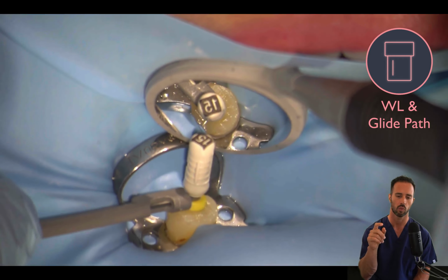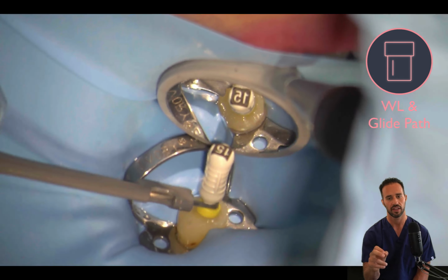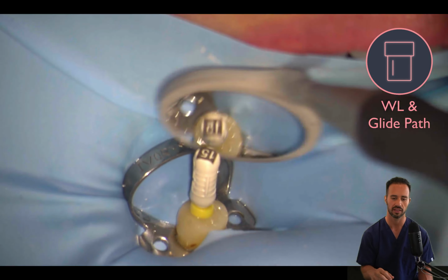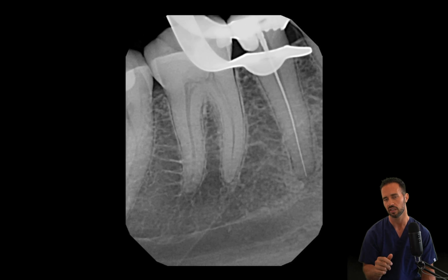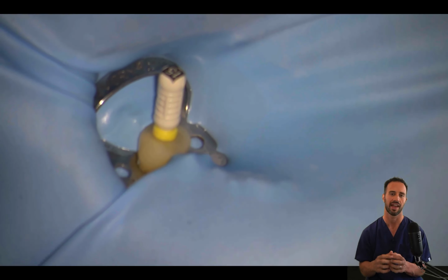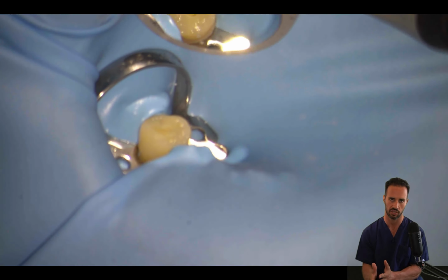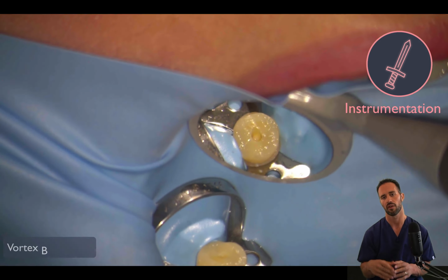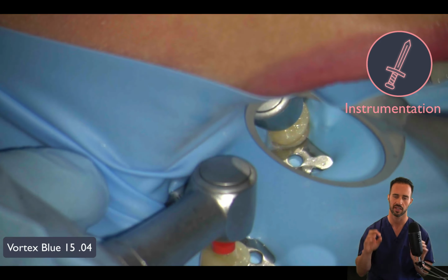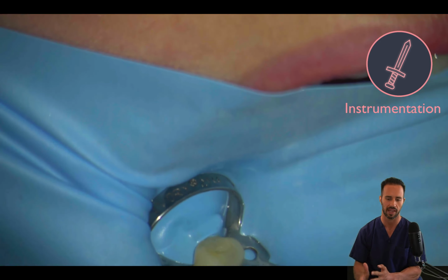And we're just getting our working length with our electronic apex locator. All right, I'm finding here that the working length is 23 millimeters. So we're going to take a working length radiograph here, and you can see very clearly that that goes right to the apex, and I feel really, really good about that working length at 23 millimeters. So now we're going to proceed to our instrumentation phase, and we're going to start with our Vortex Blue 1504 rotary file, and we're going to take it all the way down to 23 millimeters, and we're going to start working our way up the ladder.